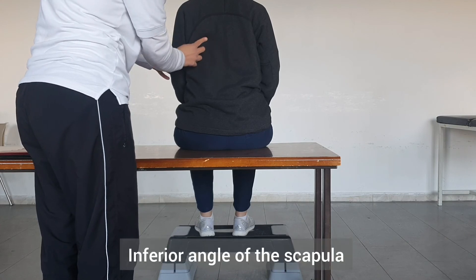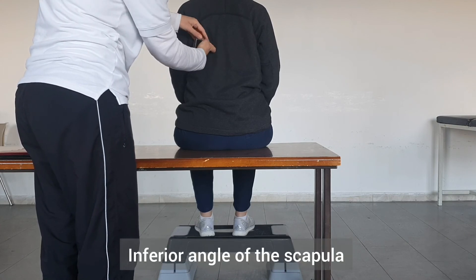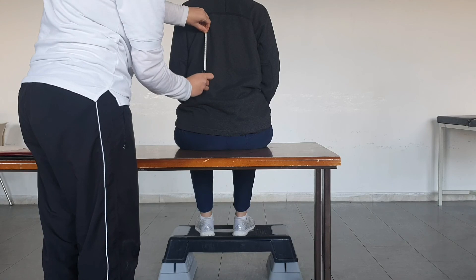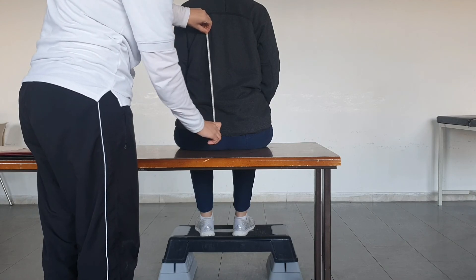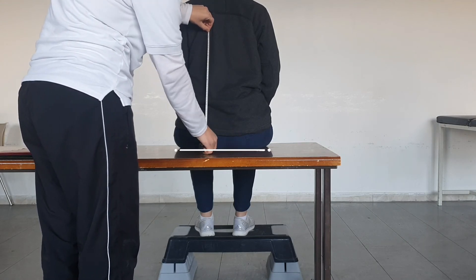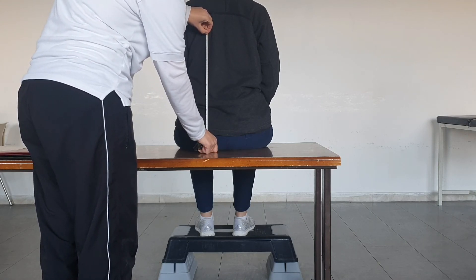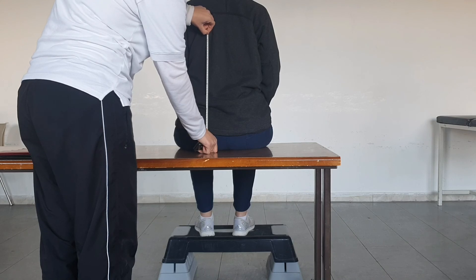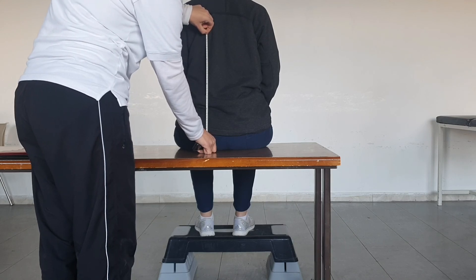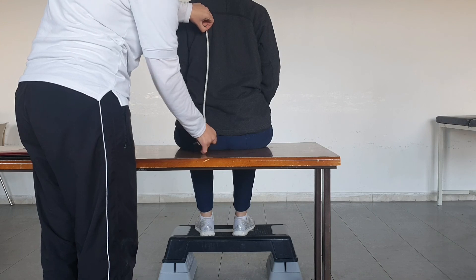For the other measurement, we will determine the inferior angle of the scapula for the patient, and we will measure the distance from the inferior angle of the scapula to the surface we are sitting on. This will help us determine the back height of the wheelchair.